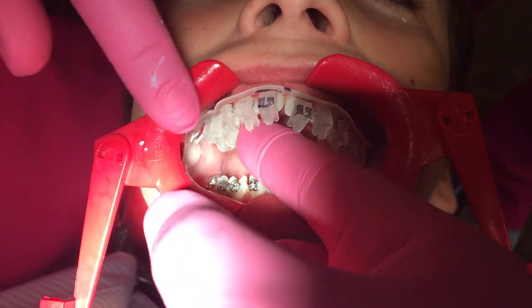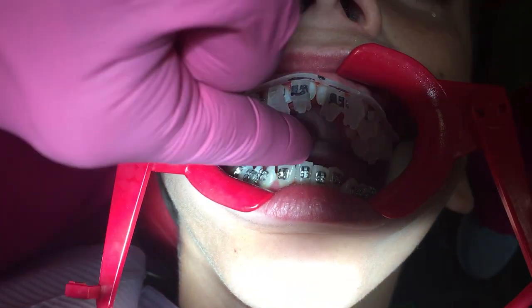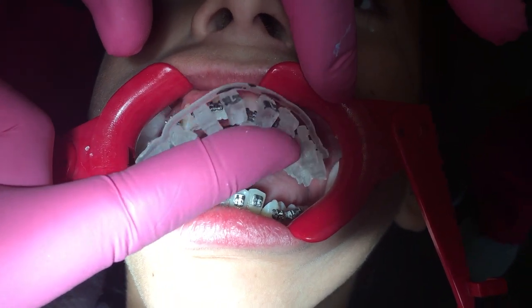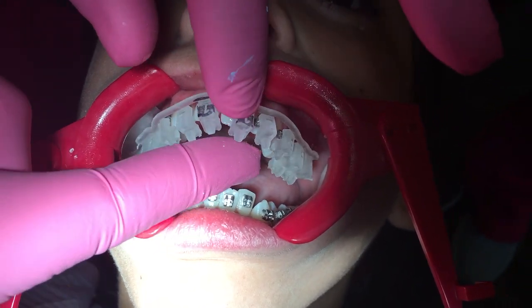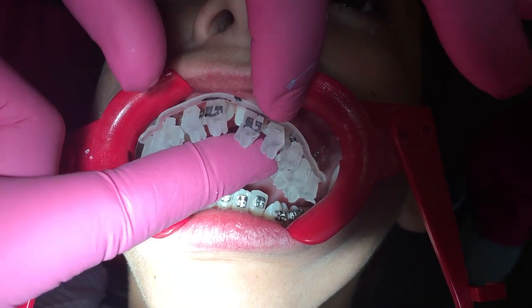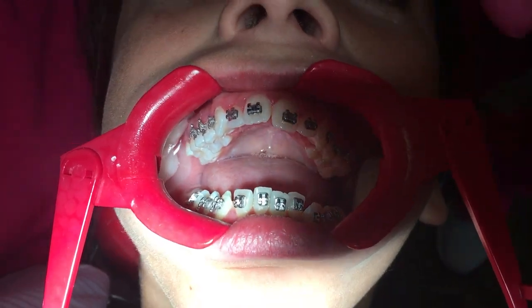Perfect. That's it. Just grab the tray from the back. Be careful with the back. Perfect. Everything stays? Good job. Yes, good. Thank you.